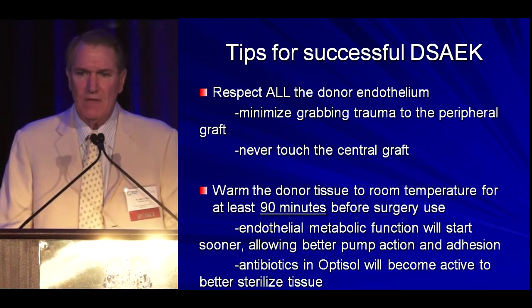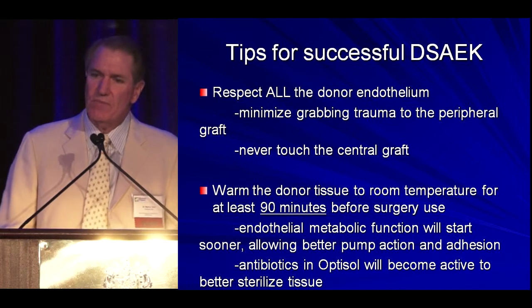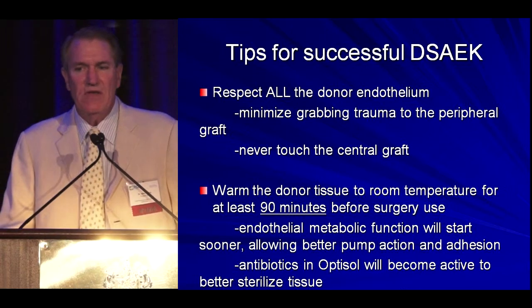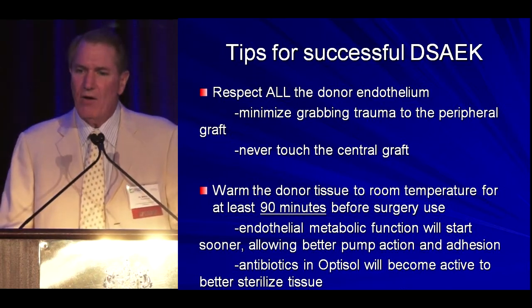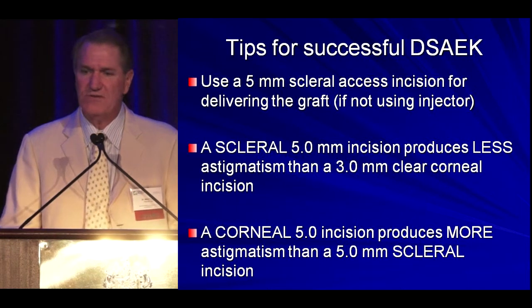You should warm the donor tissue to room temperature for at least 90 minutes before you do the surgery. The endothelial metabolic function has to start, and you want it to start soon, and this will help you in 2 ways. It'll give you a better pump action and adhesion for your graft early on, and also the antibiotics in the Optisol will become active because antibiotics are only active with an active metabolic process.